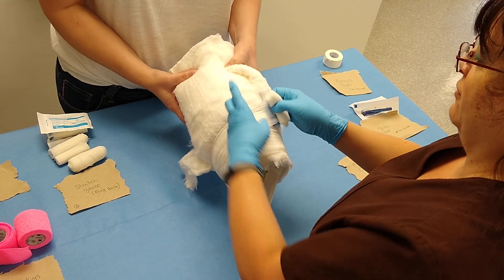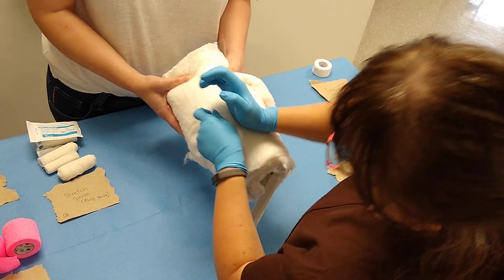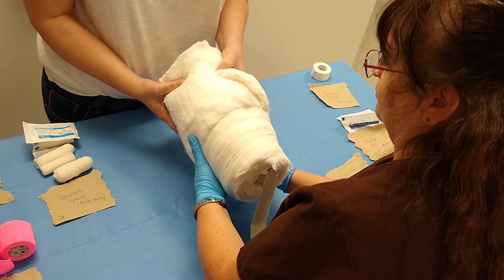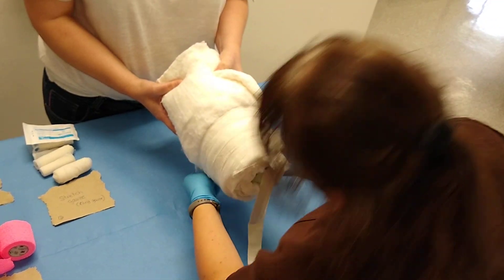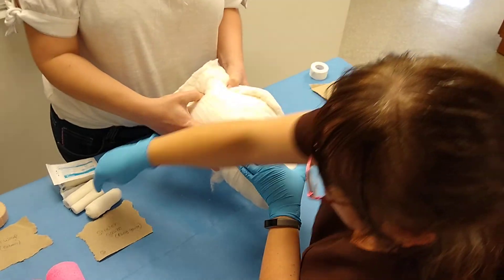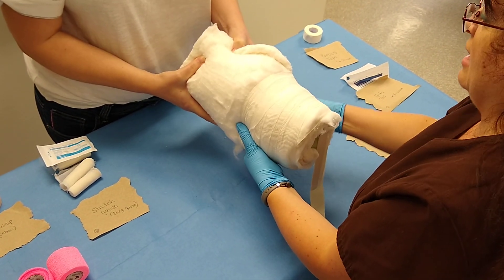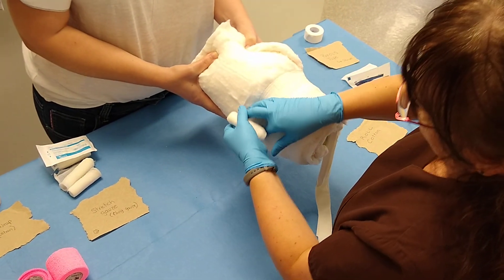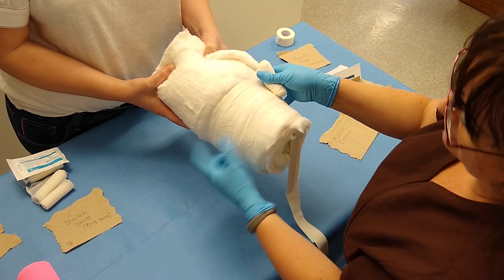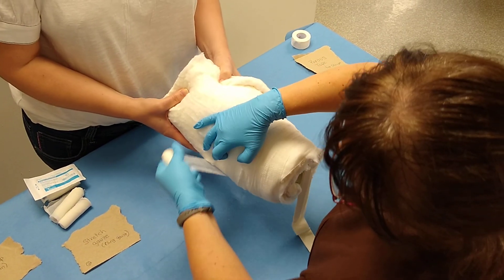You're going to aim for that 50% coverage. Because it's rolled cotton, it might slip just a little bit, so you might have to make some adjustments as you roll. You will go through a lot more material, so you want to be prepared and make sure you have enough roll cotton, stretch gauze, and vet wrap to go around the limb. When you run out of the stretch gauze, overlap it because one roll is going to keep the other roll in place.